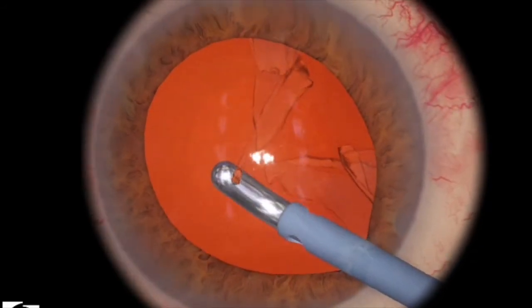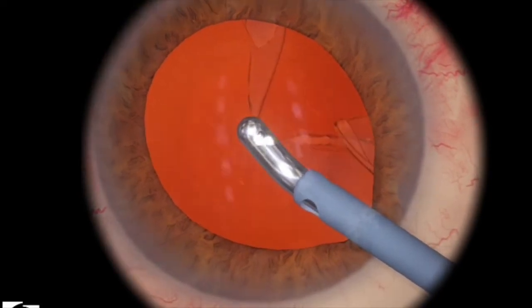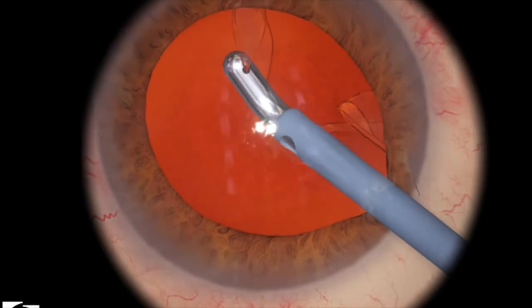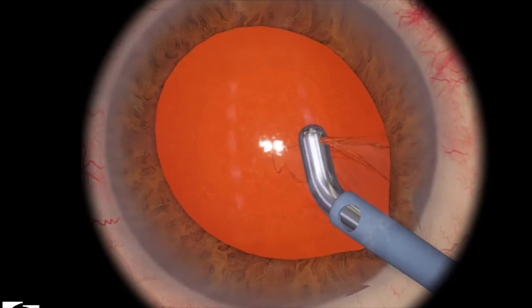When you're grabbing parts of the capsule, what you want to do is grab kind of close to where the capsule lip is, and then just pull towards the center for safety.